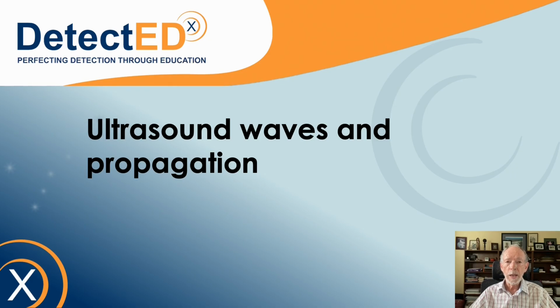We're going to start by looking at the nature of ultrasound itself. Ultrasound, as you may guess, is a form of sound. The only big difference between ultrasound and the kind of sound we can hear relates to the frequency. But if we think first about the nature of sound waves, they consist of pressure variations. So when sound is traveling in the air, pressure is being increased and decreased in a cyclic fashion, and that propagates through the air as a sound wave.